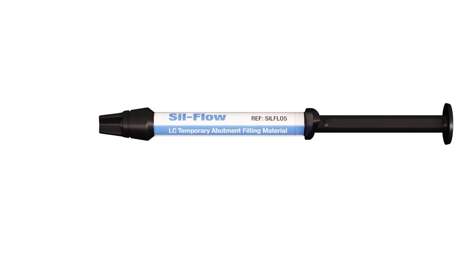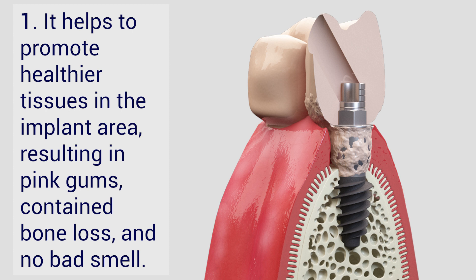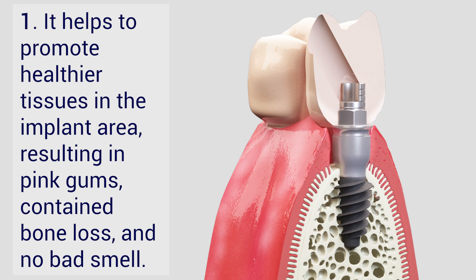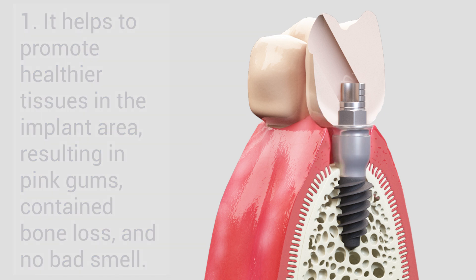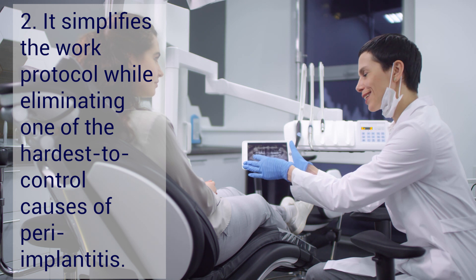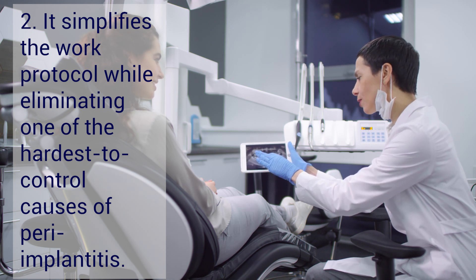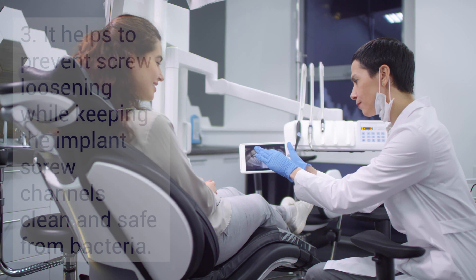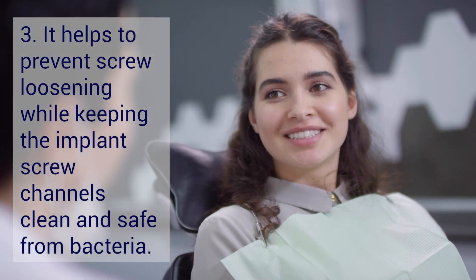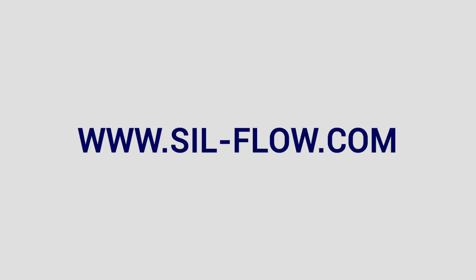Silflow provides three main benefits. One, it helps to promote healthier tissues in the implant area, resulting in pink gums, contained bone loss, and no bad smell. Two, it simplifies the work protocol while eliminating one of the hardest to control causes of peri-implantitis. Three, it helps to prevent screw loosening while keeping the implant screw channels clean and safe from bacteria.